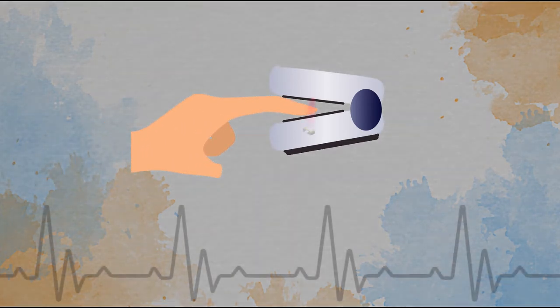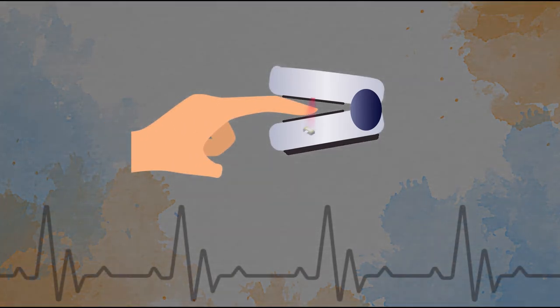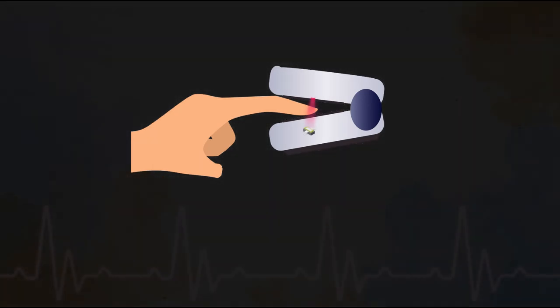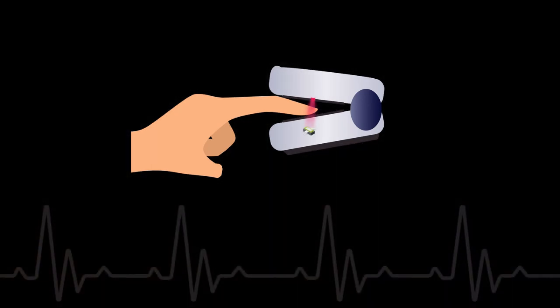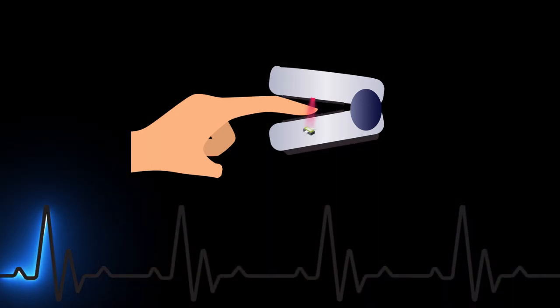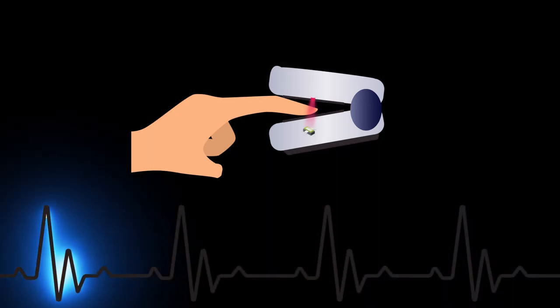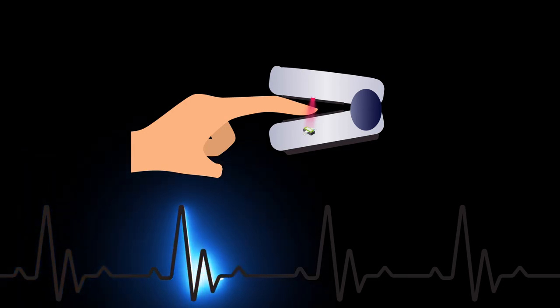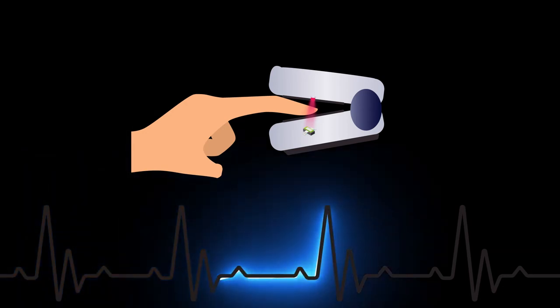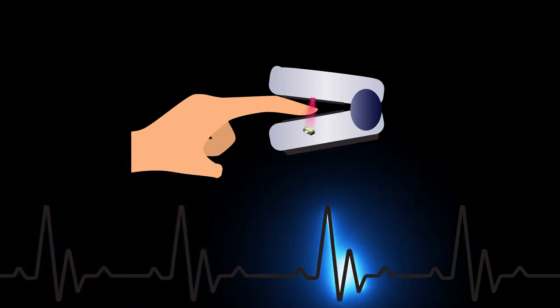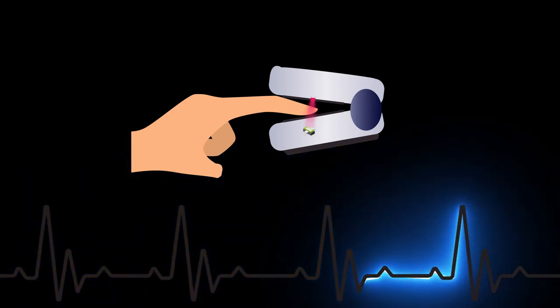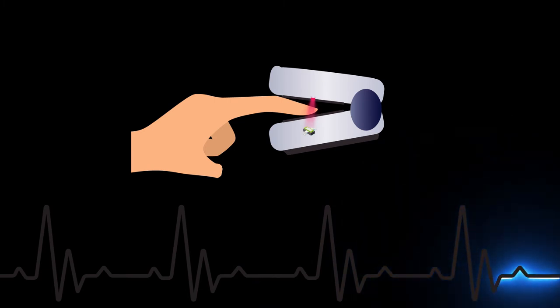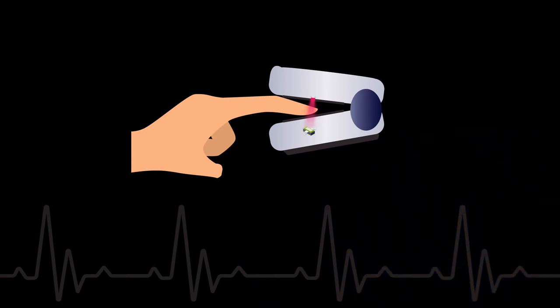Let's take another view of this particular device. After the finger is inserted, the device turns on and the two LEDs become illuminated. They shine on the finger to the sensor underneath. As the heart beats, newly oxygenated blood is sent through the arteries and the capillaries to the tip of the finger.